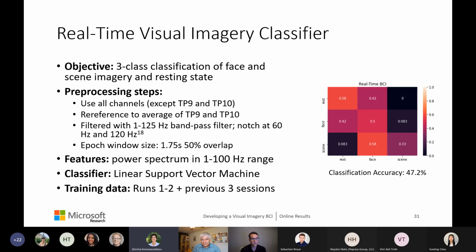Improvements that could come, because you've been taking that experiment yourself, that study yourself as a participant? Yeah, so that's a great question. Some of the things that I noticed about this experiment, first off, it did seem that we saw some improvements when we were adding that additional data from other sessions. So it does seem like we are a little bit limited just by the amount of data that I was able to collect from myself each session.